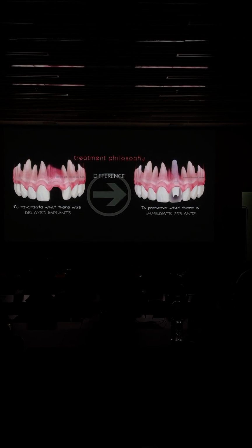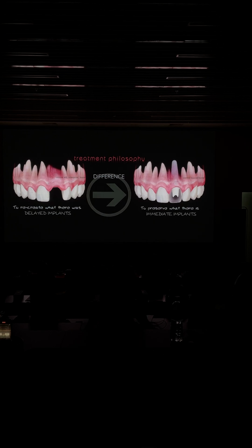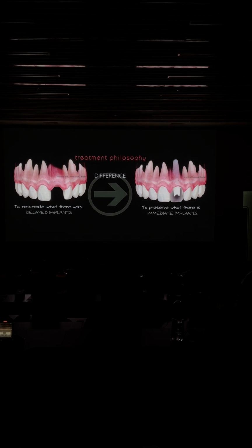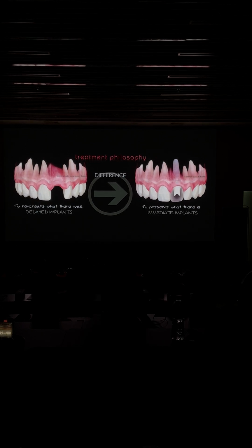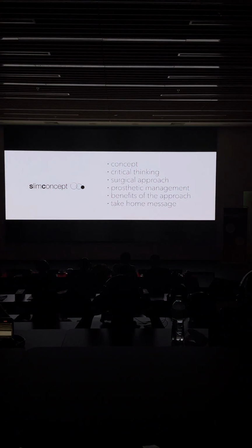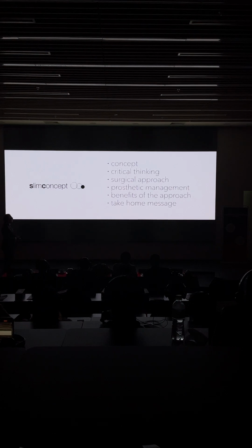Every time I'm going to place a single tooth implant in a delayed mode, and I have sufficient buccolingual bone, I elevate my flap partial thickness. I try to avoid as much as possible exposing my bone, because I have already 30% of resorption only by exposing the bone. So let me show you the slim concept, how we started.